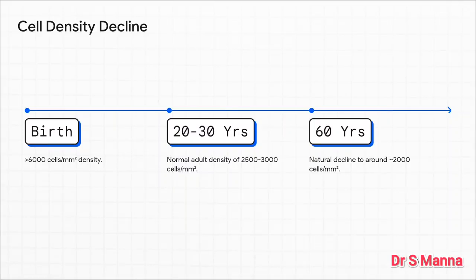Understanding this age-related decline is absolutely paramount, guys. You do not want to misdiagnose natural aging as some rapid, aggressive disease state.